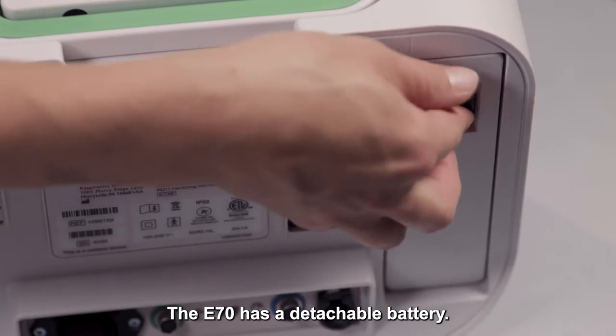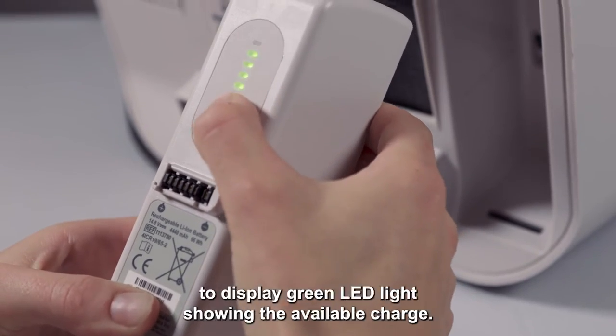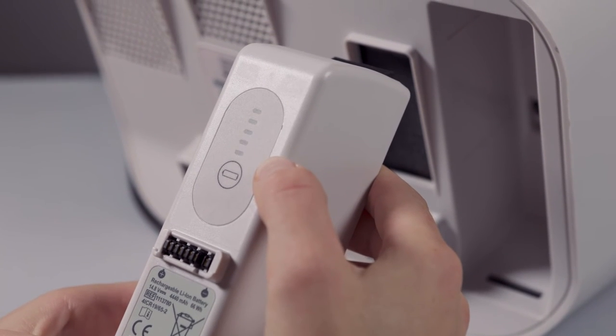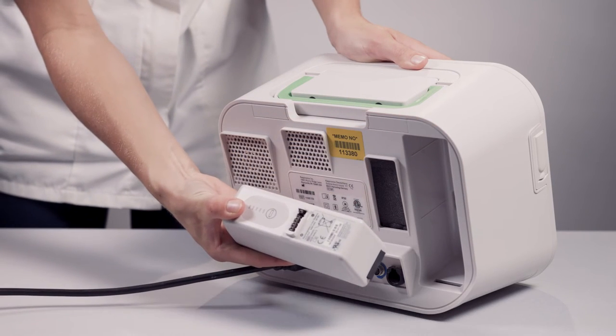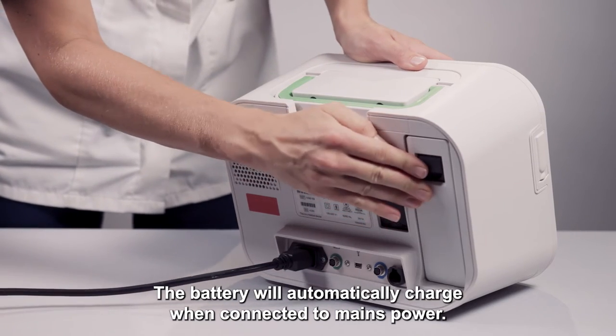The E70 has a detachable battery. You can press the button on the back of the battery to display green LED lights showing the available charge. A fully charged battery provides approximately three to four hours of power. The battery will automatically charge when connected to mains power.